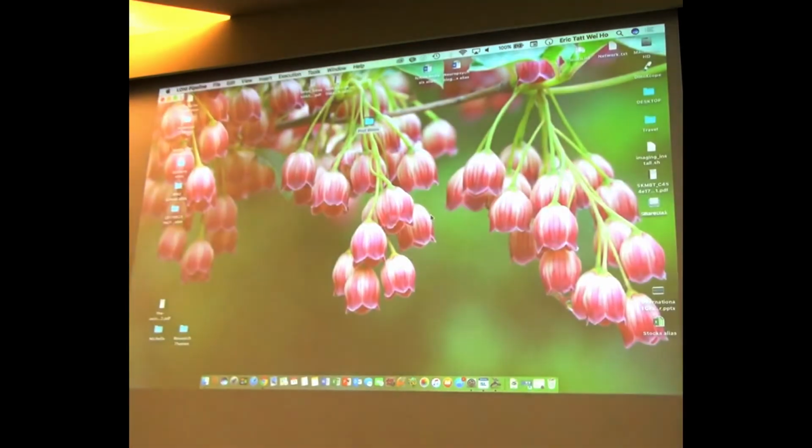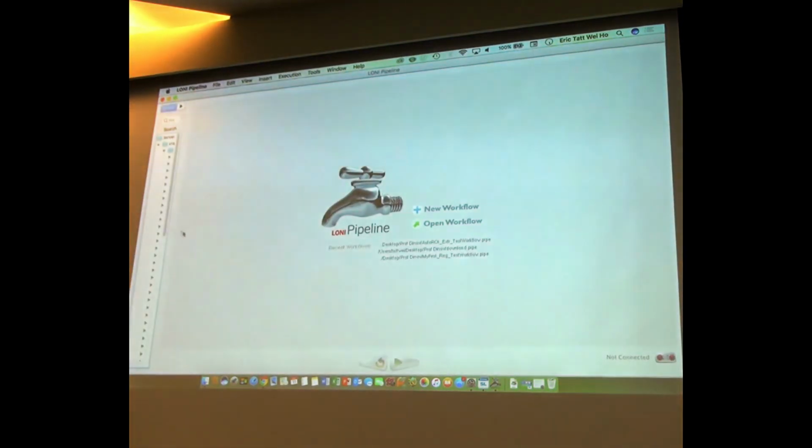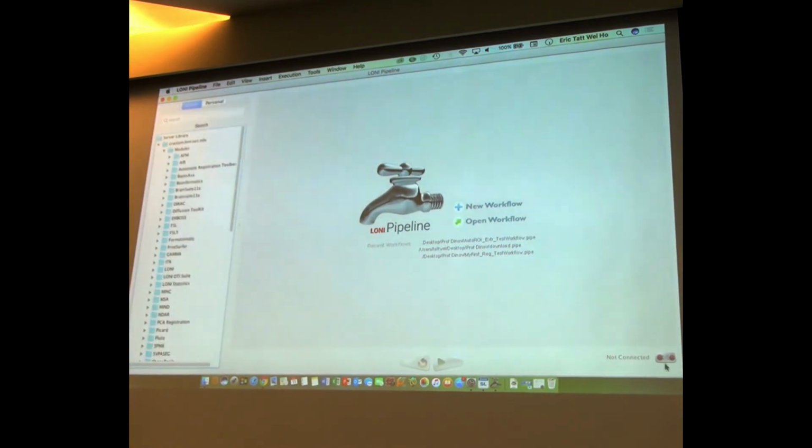Okay, that's good. Alright guys, so here are my 4 sessions. We just restarted the app.